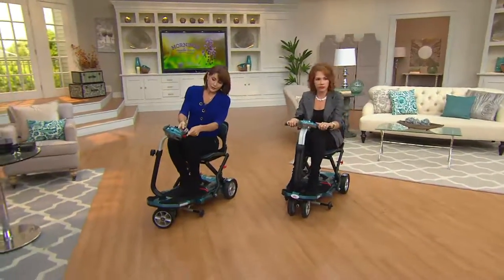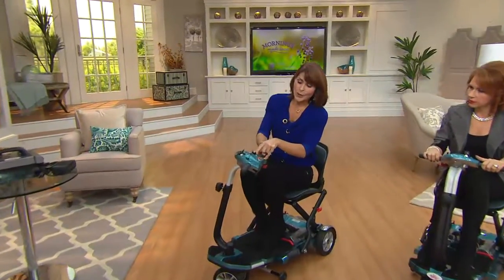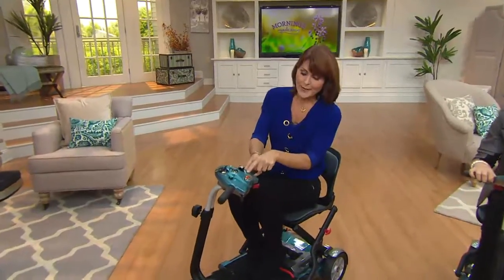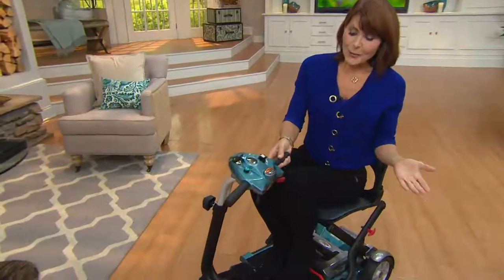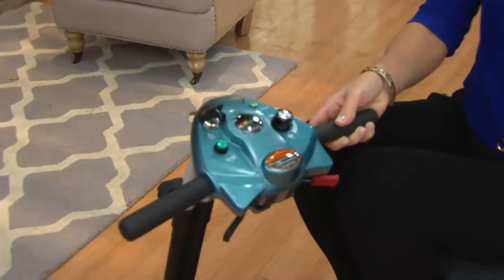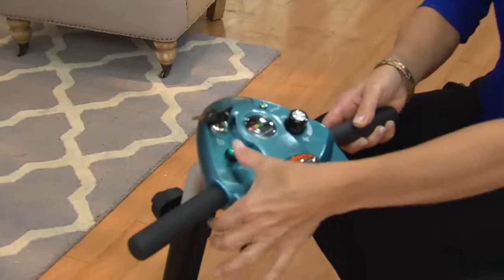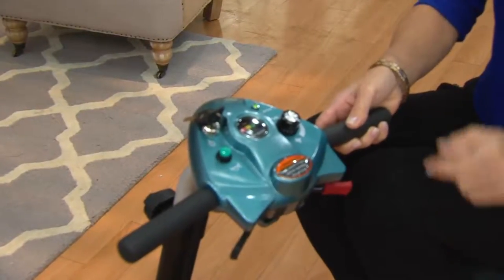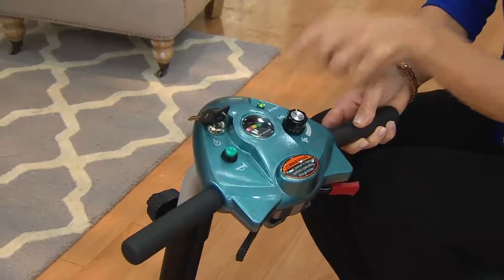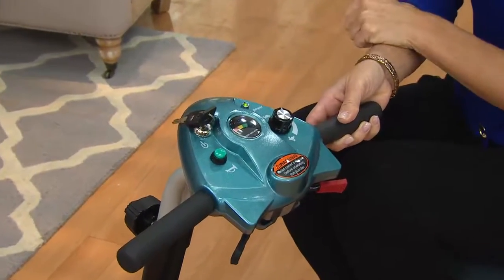Here's the red lever — you push the red lever to go forward, the black lever to go in reverse. You have speed control which goes from turtle to rabbit, which is four miles per hour, and you can adjust the speed as you're driving — you don't have to establish it before you start. We give you two keys. There's a little horn so people know you're coming and going. This indicator light will flash twice to let you know you have power, and there's a gauge that lets you know when you need to charge.